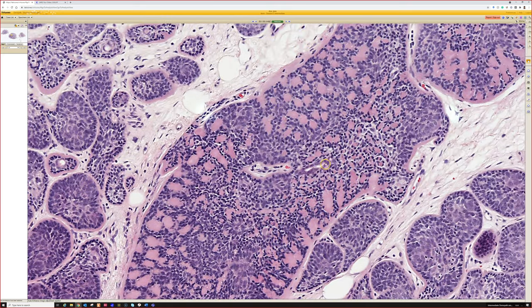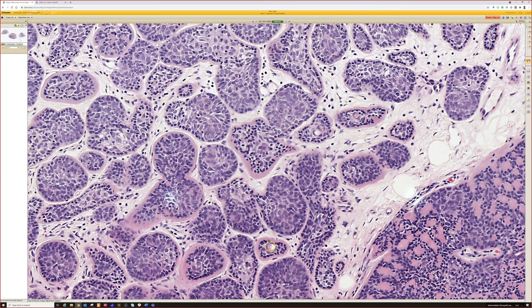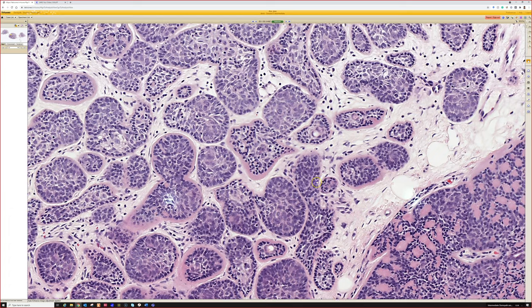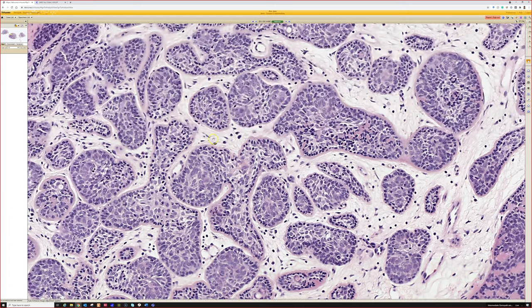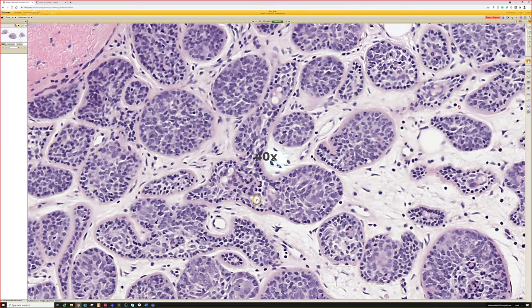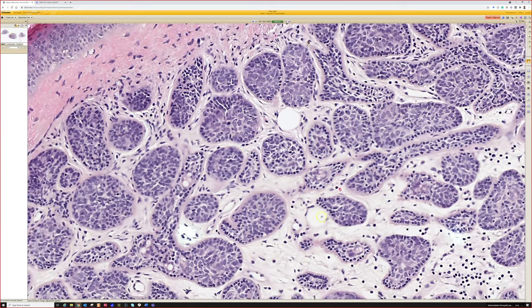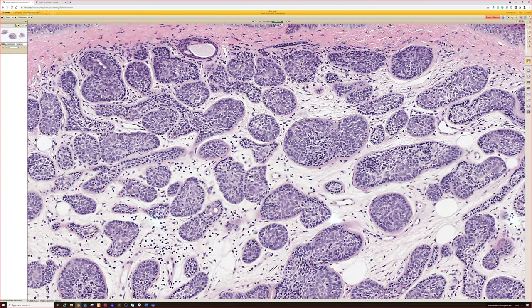So here you can see them. Here's one duct right here. Now this is not a duct, that is a blood vessel actually. Here's a duct right here. And the ducts have a very discrete, sharply circumscribed little space usually, often lined by a little pink layer called a cuticle, which is kind of hard to show as well. Oh, there, that's better right there. See how they're like perfect, punched out little holes, like with a little hole punch. And then they've got a nice little layer of pink around them, and that cuticle can help you tell, yes, it's a true duct right there, rather than an artifactual hole, all right?